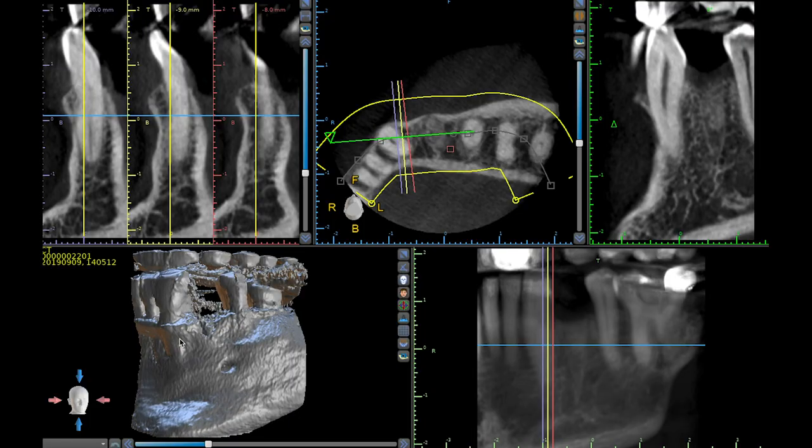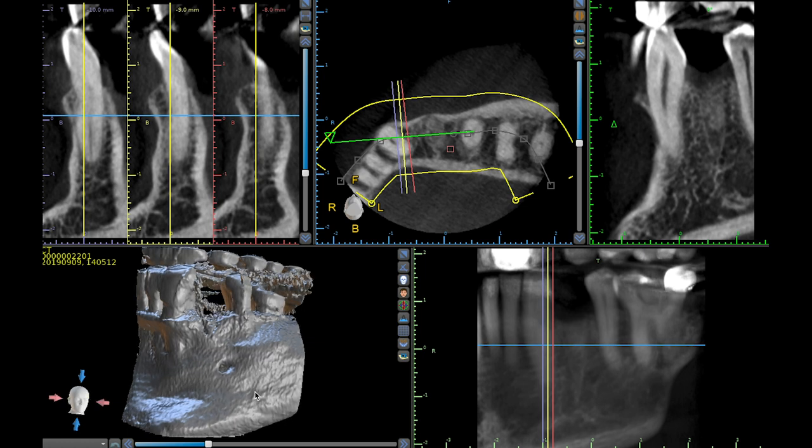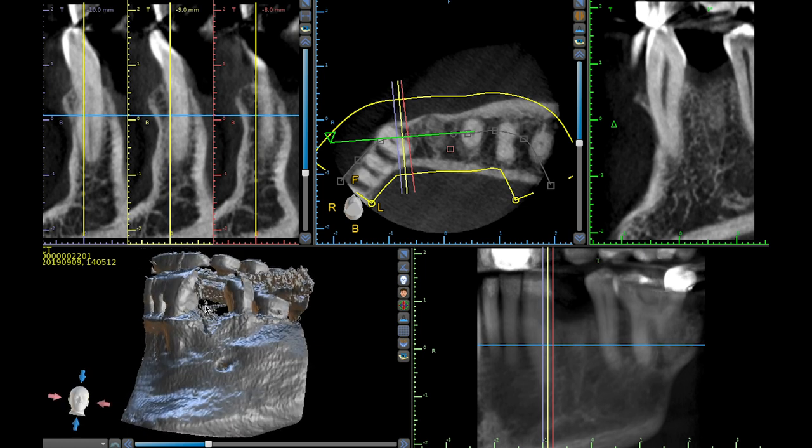Alright, so first let's take a look at the patient's x-ray. This is his cone beam and I'm looking at it in Blue Sky Bio. It's number 21 that I want to place the implant into. My main concern at number 21 is this mental foramen right here — I want to make sure to stay far enough away from it.